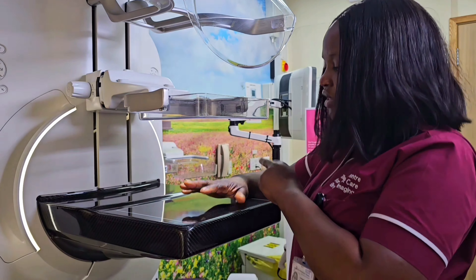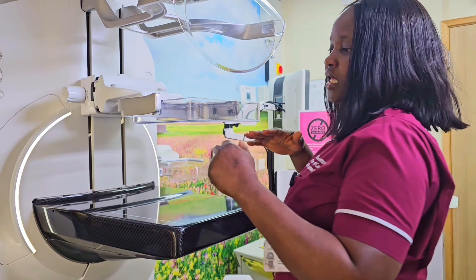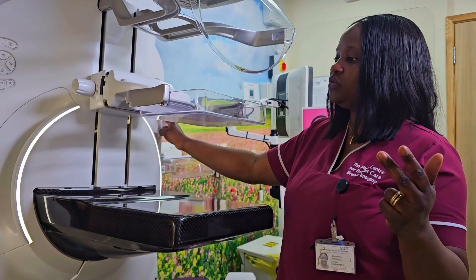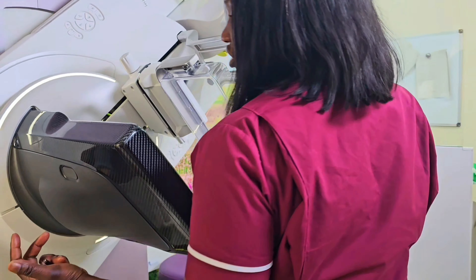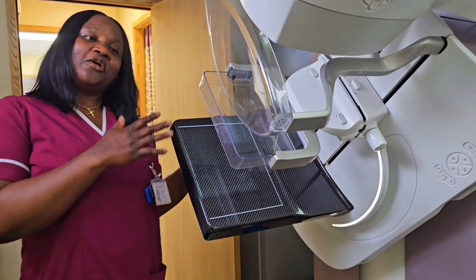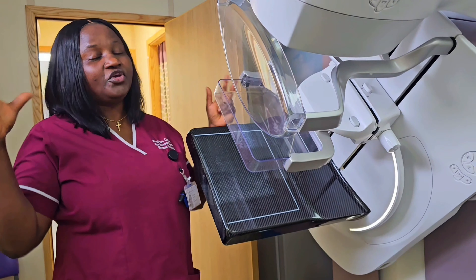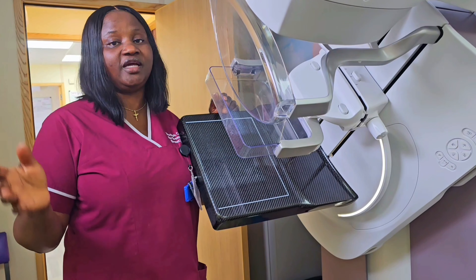After that, the compression releases the breast on its own. When this is done for one breast, it is done for the other breast. We also take a side picture of each breast, so we do another picture from the side of each breast to enable the film reader or the radiologist to be able to see all sides of the breast as much as possible.